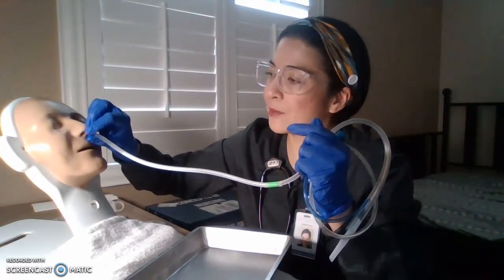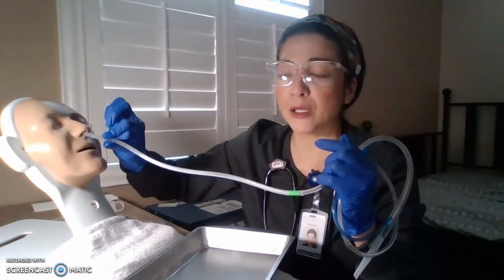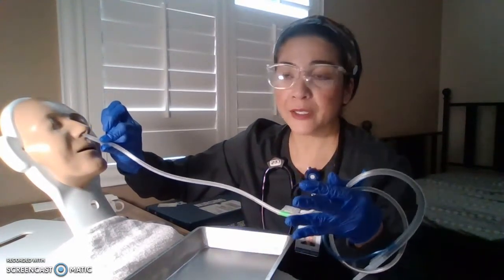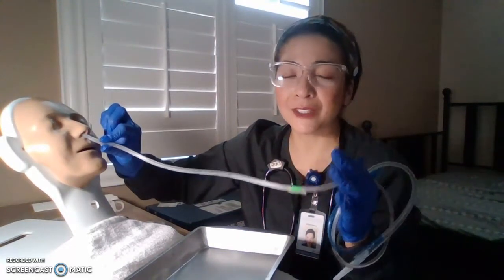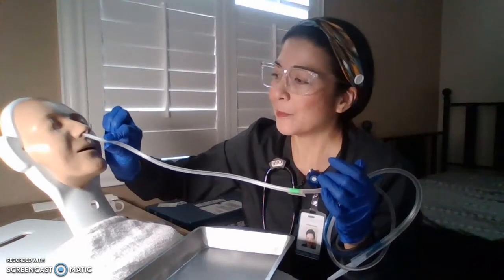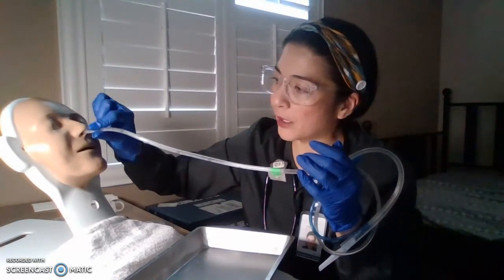All right, so at this point, you may feel some resistance. What do you do? You move back, you withdraw. You may want to relubricate, or you may want to use another nostril if it really doesn't want to go in. All right, so at this point, there's no resistance, so I'm going to keep on going.